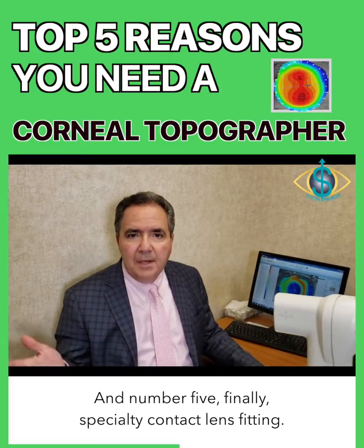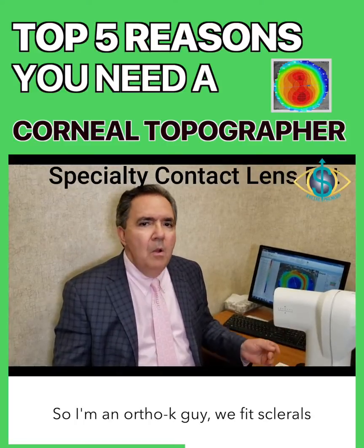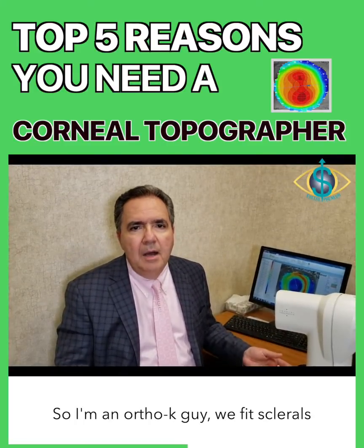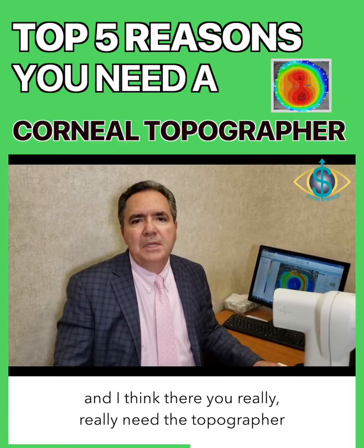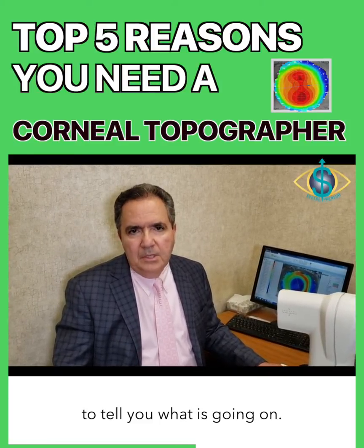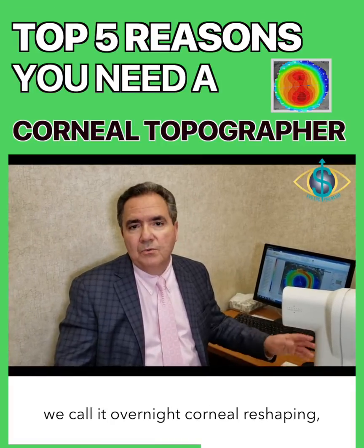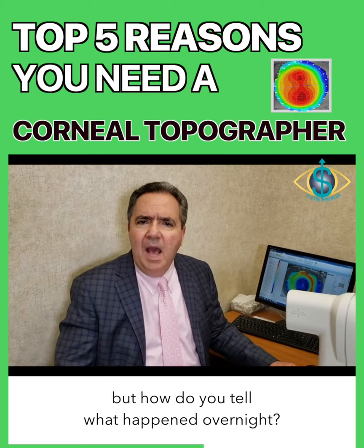And number 5, finally, specialty contact lens fitting. So I'm an Ortho-K guy, we fit sclerals, and I think there you really need the topographer to tell you what is going on. So in Ortho-K, anybody could fit orthokeratology lenses. We call it overnight corneal reshaping. But how do you tell what happened overnight?